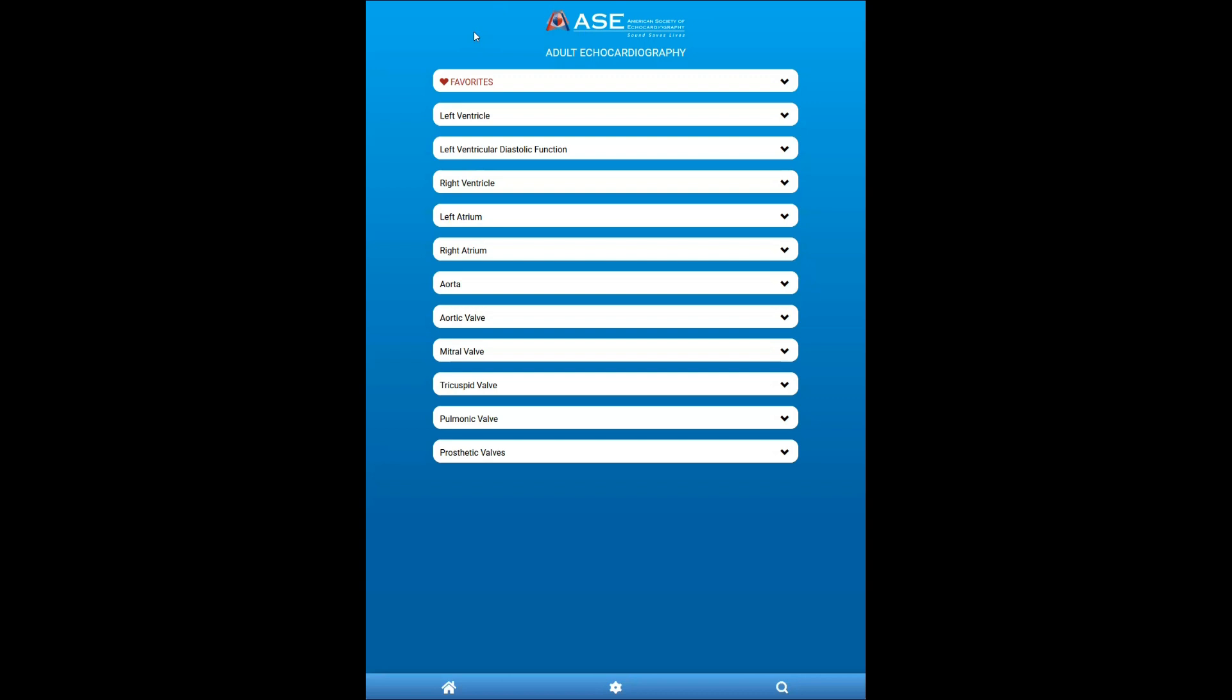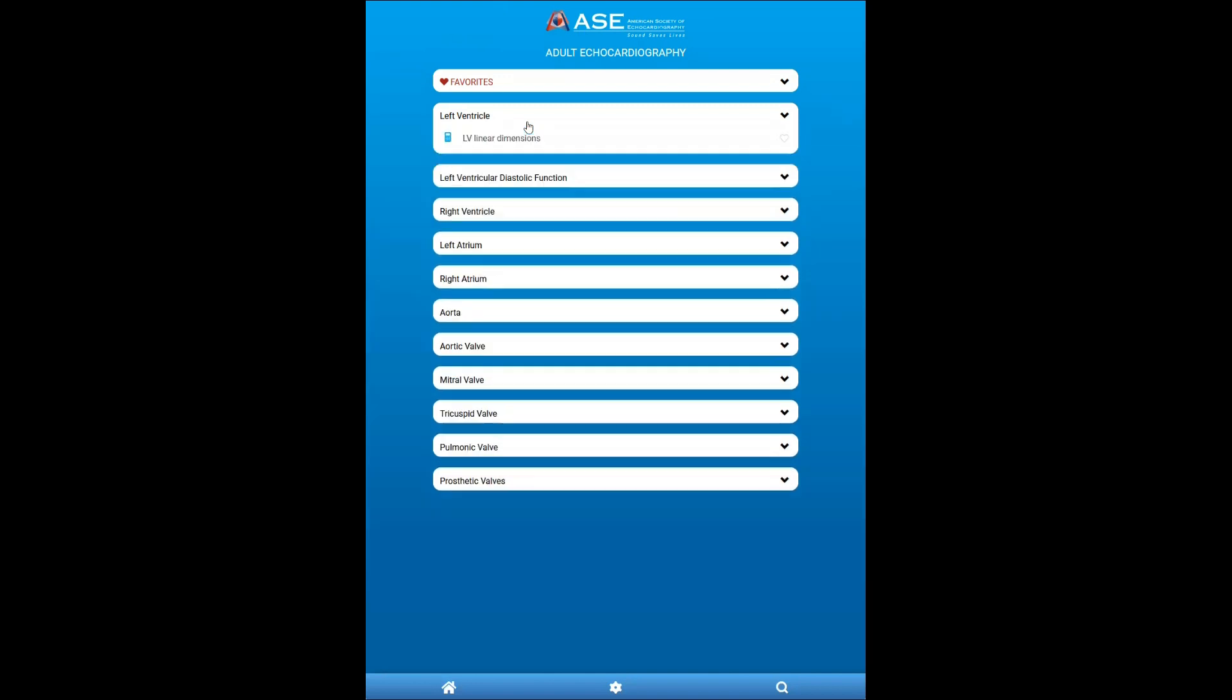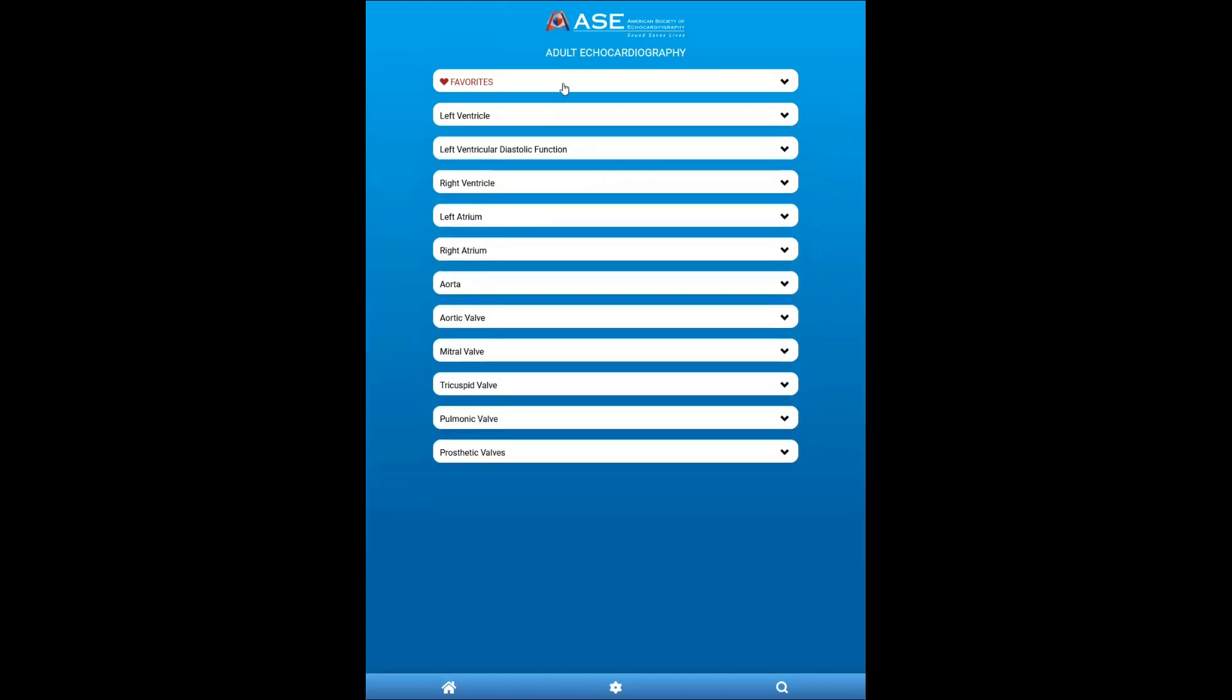The calculators, algorithms, and tools are all grouped based on cardiac structure. And then you can favorite different items, which will create a separate list.